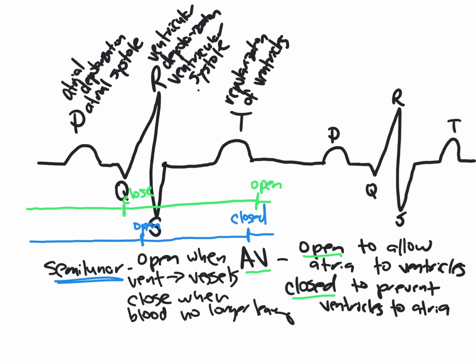The last portion of your assignment everyone seemed to do okay with, and it was answering the question of what can you learn by measuring from your R wave to R wave. I could have also said, what would you learn by measuring T to T or P to P? Just the idea that you start at one point in one complete cardiac cycle and make it to the same point in another complete cardiac cycle. And that's going to tell you how long it takes to complete a single cardiac cycle and can be interpreted as heart rate. So I hope that helps.